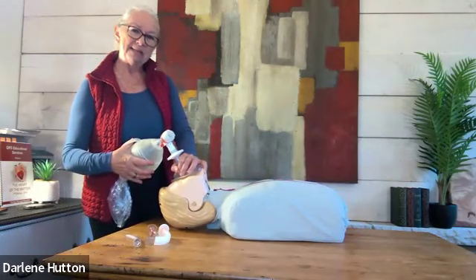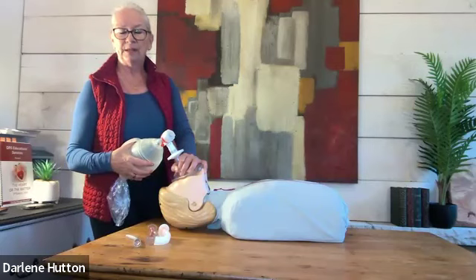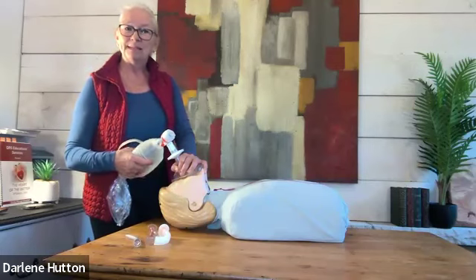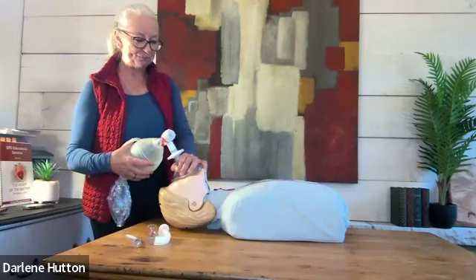Okay, so every 6 seconds. And it is important that you count out loud in your mind. Do not get distracted by talking, because sometimes that means that you will hyperventilate your patients.